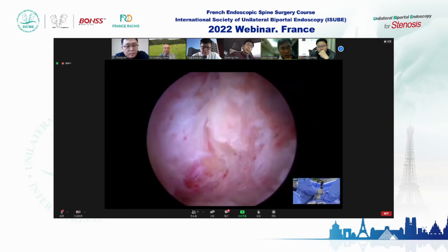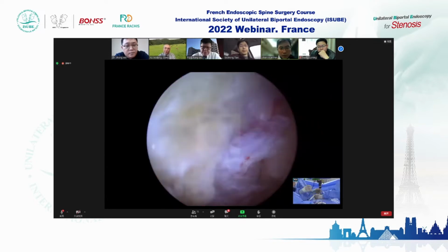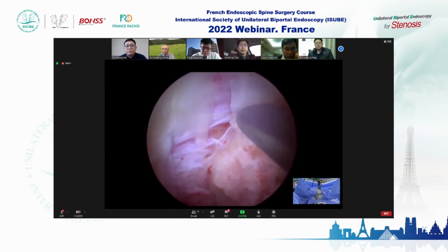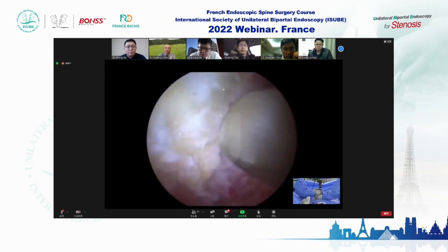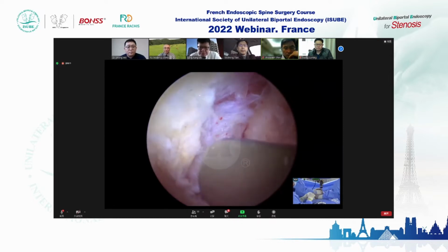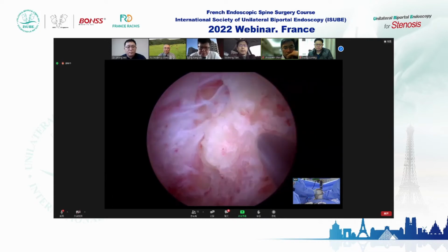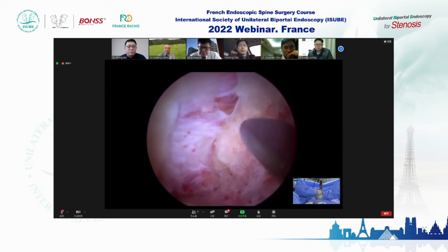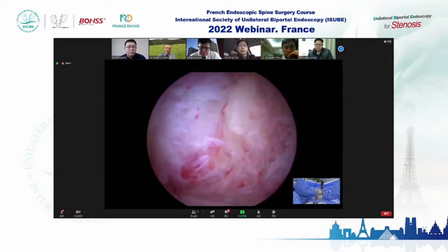I think it's easy to try to touch the upper end of the pedicle. And then she also takes some pedicle. You know that the epidural vein is just below the ligamentum flavum. I don't touch the epidural vein, so there is no bleeding of this type. Here, the pedicle is here. The pedicle is the second landmark. I will emphasize again, the pedicle is the second landmark. Here, medial margin, cranial, lateral here.